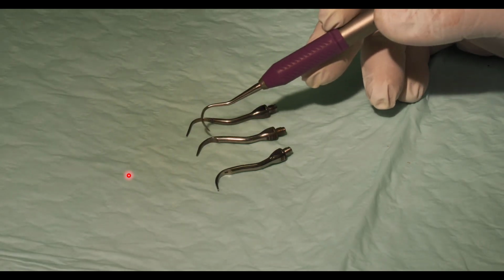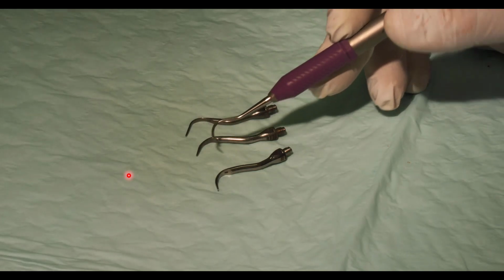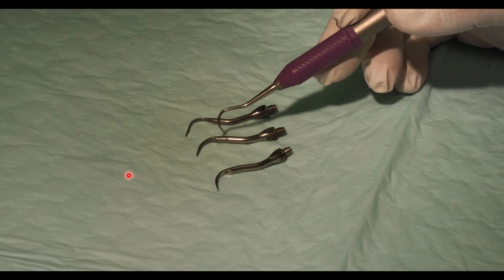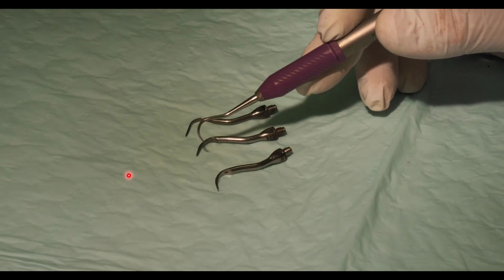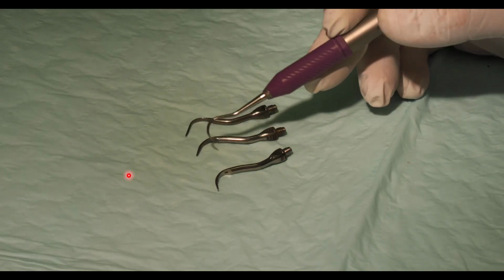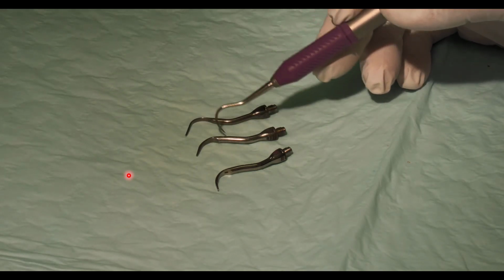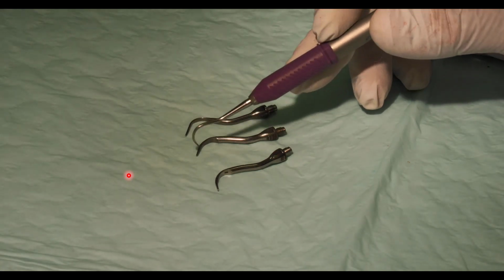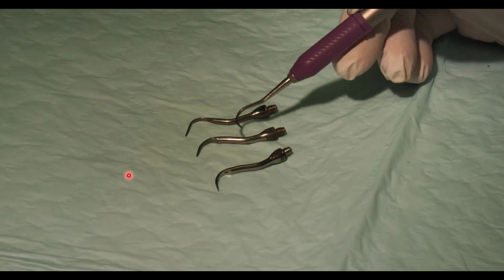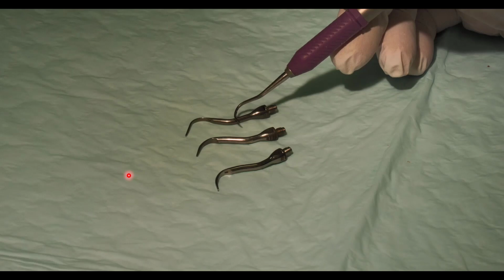This one here in the middle is a little bit thinner than this one, but thicker than this one. This is called a universal tip. This universal tip can be used anywhere. It does work well on the surface of the teeth, but not as well as this one. And it does clean up underneath the gum, but not as gentle as the subgingival tip. This one you can use anywhere, and I generally recommend that most general practitioners use a universal so they don't make a mistake of using the wrong one in the wrong spot.